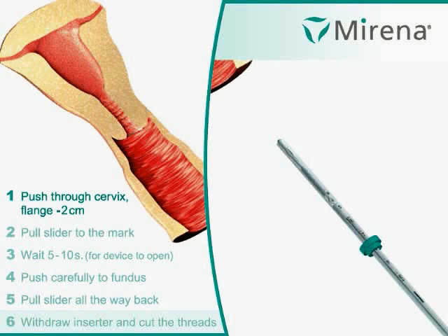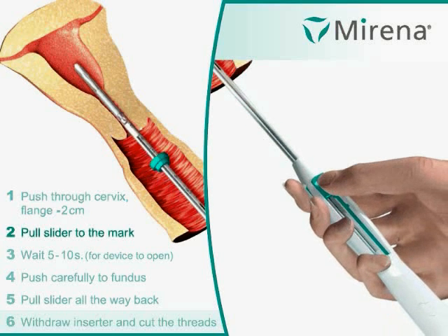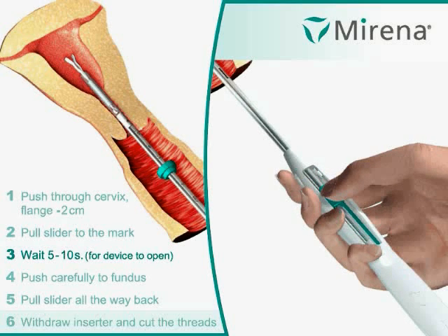Step 1: Push through the cervix, flange minus 2 cm. Step 2: Pull the slider to the mark. Step 3: Wait 5 to 10 seconds for the device to open.